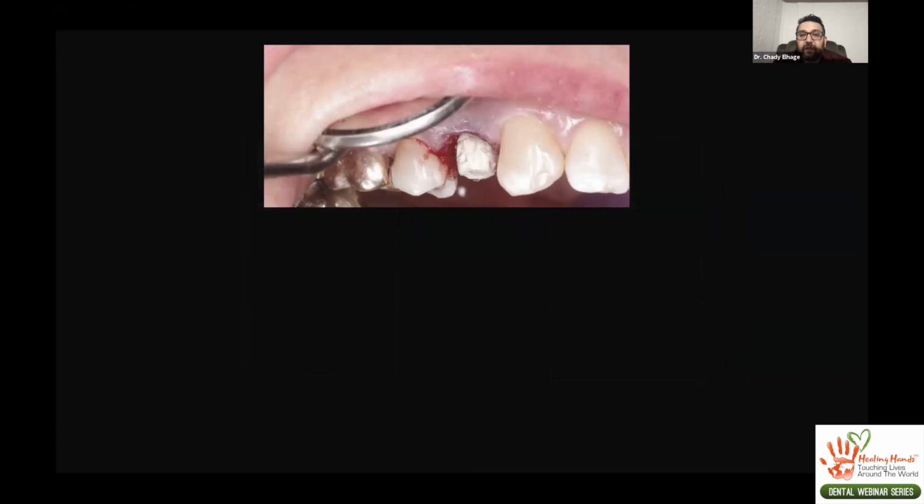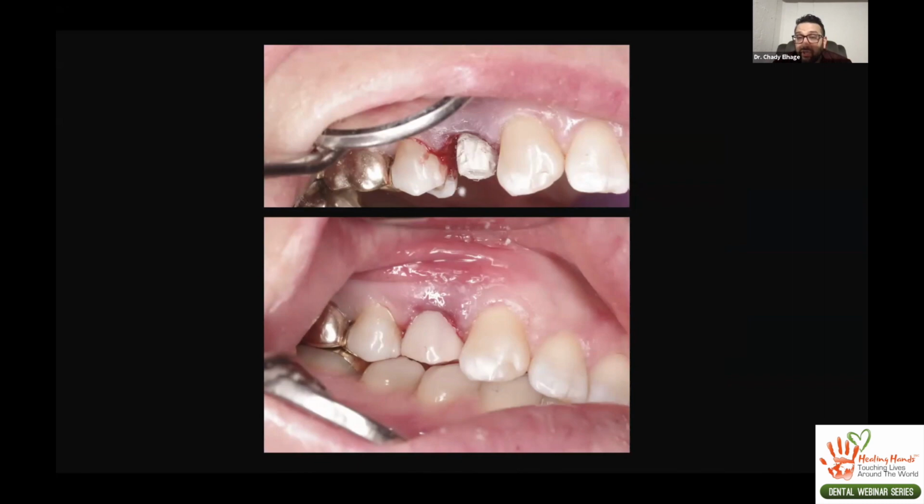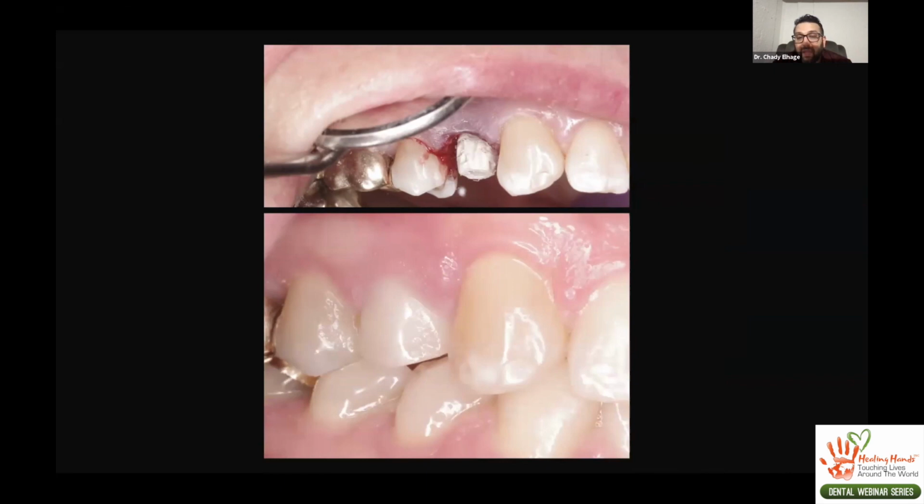So we always roughen up the cylinder so we get a good bond of material in there so nothing comes apart. Our temporary is in place. You can see there's some space. It's out of occlusion. It does not touch the teeth as the patient grinds. We always make some sort of soft guard or retainer for the patient to wear at night just for grinding. And then obviously the patient knows they're not eating on that tooth. They're not biting on that tooth. They're very, very conscious. And that comes back to what I was talking about earlier, your compliance.